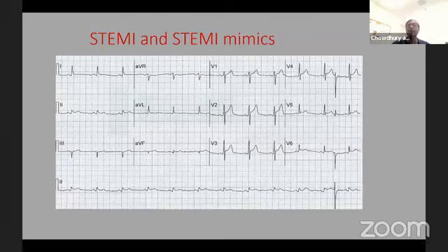No, because look at the EKG, it doesn't look that way. You can do troponin, and the troponin will be perimyocarditis type, small and undulating, not a rapid rise and fall. In the past, we used to do CPK-MB, which has faster kinetics. We have taken that away. Now we have to deal with the troponin, but still okay. If you're in doubt, you can do a bedside echo and see how the LV is, because arguably if this is LAD, then transmural, you should see wall motion. Make sense?